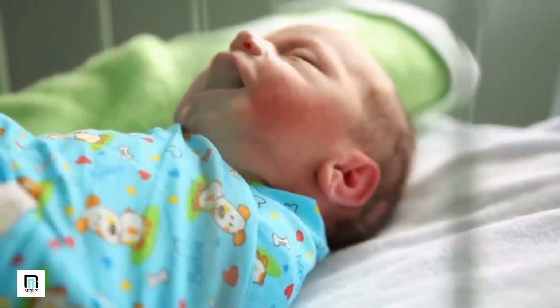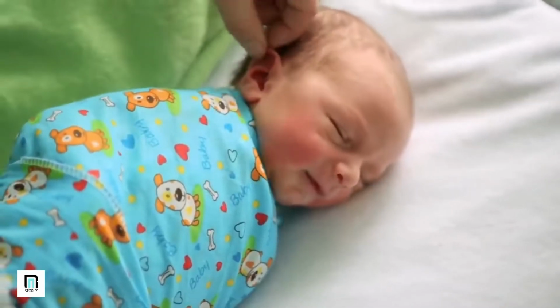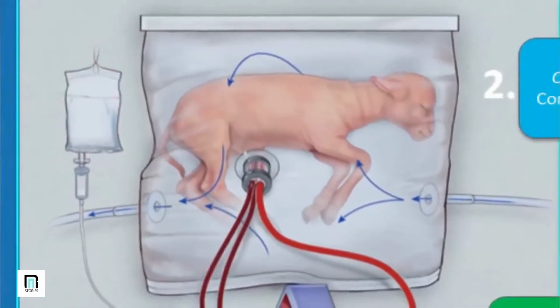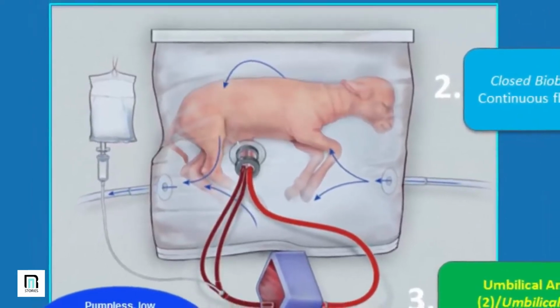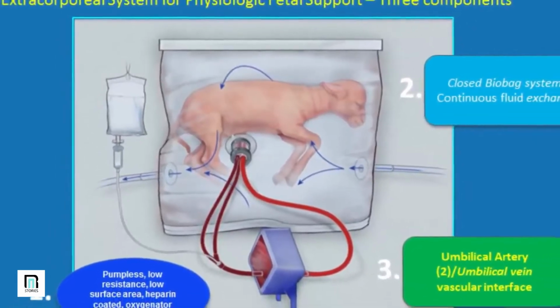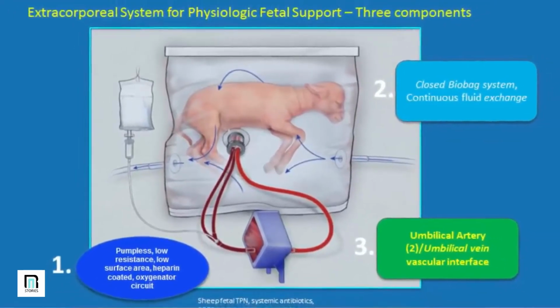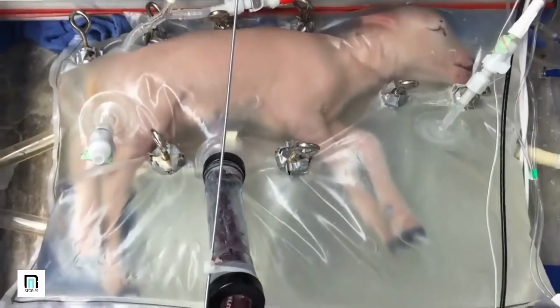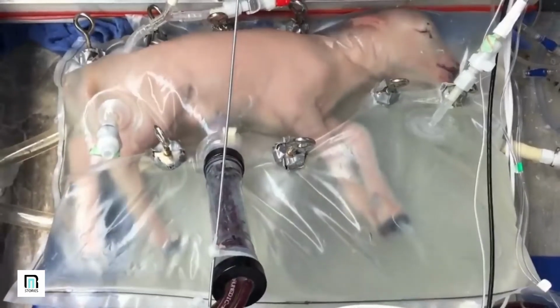Babies supported in incubators are prone to infections, for instance, and the gas ventilation that is needed to help babies breathe can leave them with lung damage. But the plastic bag system provides a sealed environment that should protect a fetus from infections. To mimic the environment of the uterus, the team filled their bags with fluid comprising water and salts. In place of a placenta, which supplies a healthy fetus with oxygen and other substances, the team connected oxygenator devices to the umbilical cords of the developing lambs. Instead of pumping oxygen into the lambs, the team developed a technique that uses the animal's own heartbeats to drive the collection of oxygen from the device.